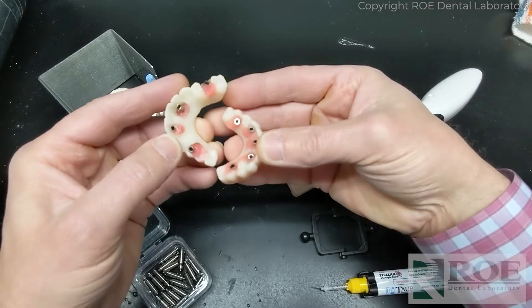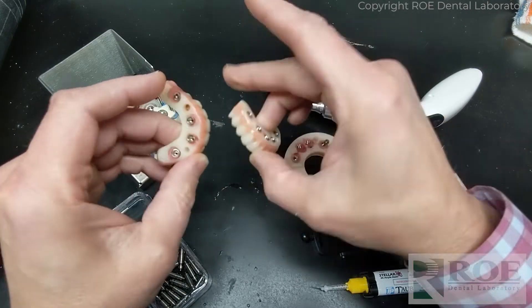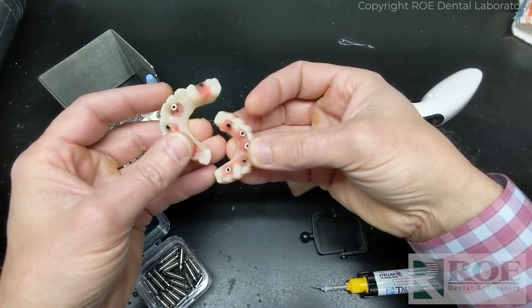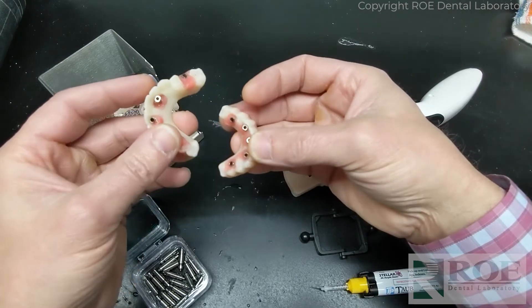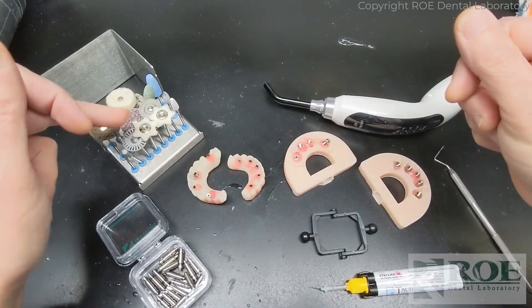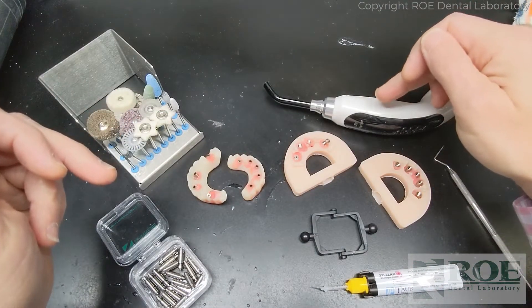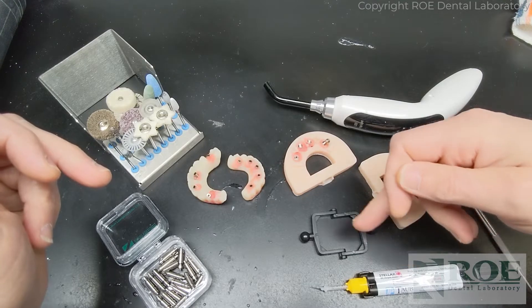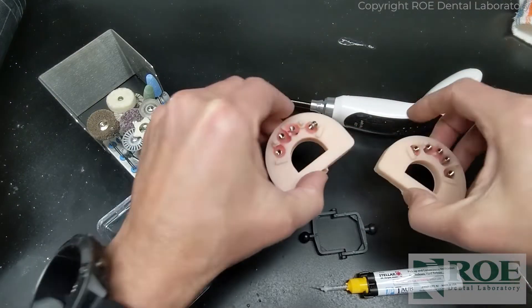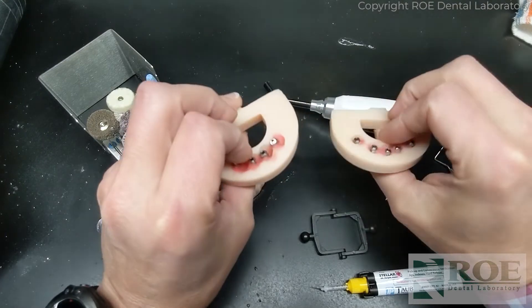As you can see, these need some work, but it's really not very complicated and a staff member or doctor can complete this. What we're going to use is a bur kit, a light cure unit, stellar material, and then the models that were created during the surgery.